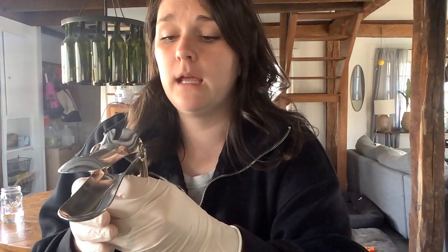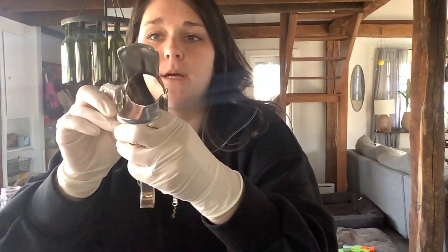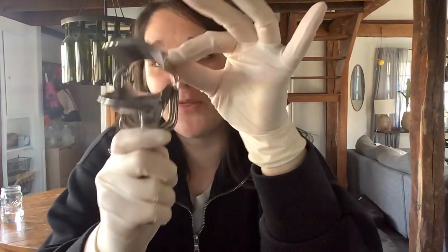I'm only opening it until I visualize the cervix, so I don't necessarily need to open it all the way, but just until I see the cervix. So once I see the cervix, I can stabilize this with my screw right here. And then, okay, I'm going to look at the cervix.